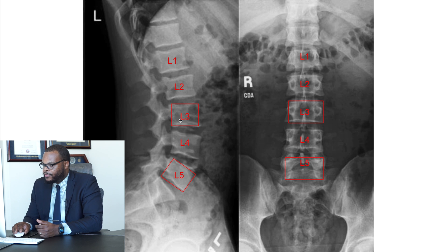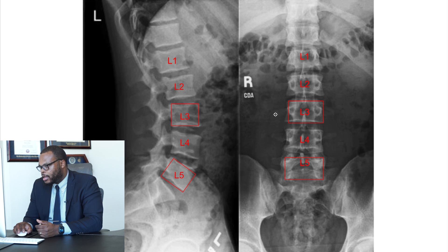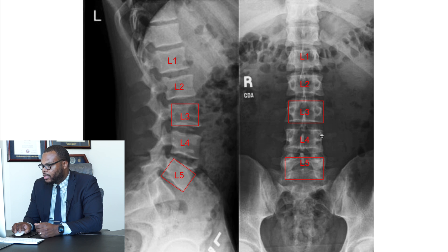You can see the shapes of these bones are pretty square and nice. We have our spinous processes, which are the prominent areas in the back — if you feel along your lower back, you can feel these. You have your transverse processes on both sides, which we call TPs. And these are the pedicles here — these little dots, two at each level. This is anatomy I look for in surgery when placing pedicle screws. My goal is to put a screw right into that pedicle so it ends up into the vertebral body.